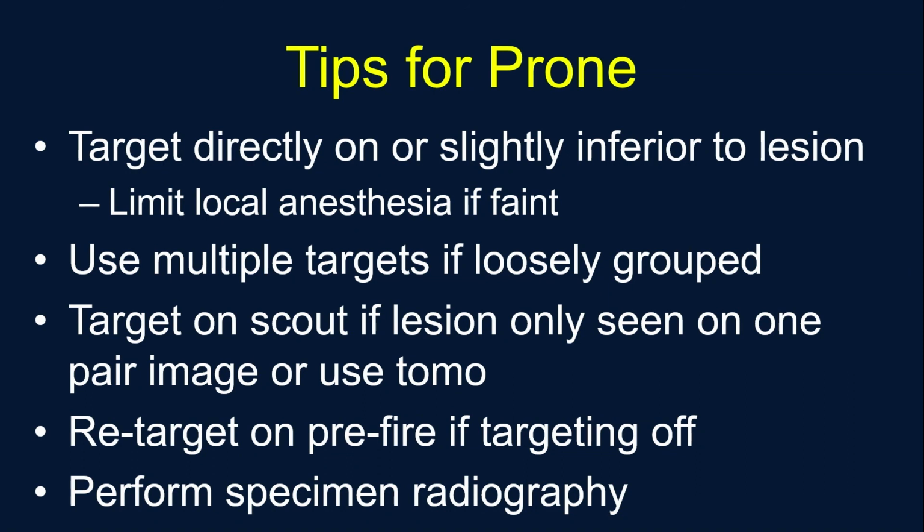Honestly, in my experience, most patients do very well with a very good skin wheal, and they don't really need that much deep numbing, particularly in the beginning of the procedure. And the devices we're using now often give the anesthesia while we're actually doing the biopsies. Use multiple targets if there are loosely grouped calcifications. You can target on scout if the lesion is only seen on one view, or use tomosynthesis to guide.